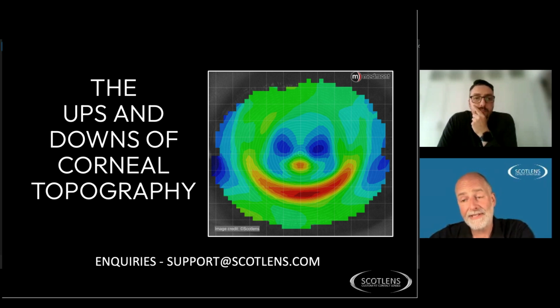It still wasn't enough for the dry eye module to kick in, but I could see an improvement. As a general rule, you don't need to put drops in to get good topography. Most topographers will get reasonably good topography, even in a dry eye patient. In fact, you don't want to put drops in because it makes the eye too moist, and you end up with a big lacrimal lake reflection at the bottom and all the rest of it.